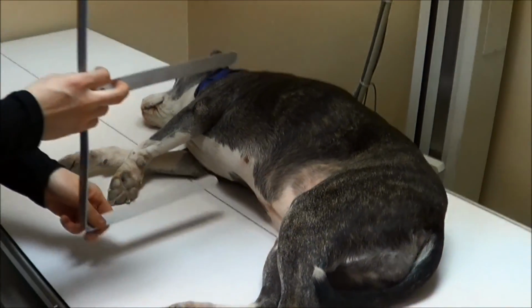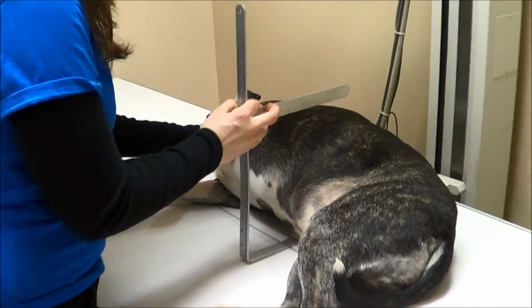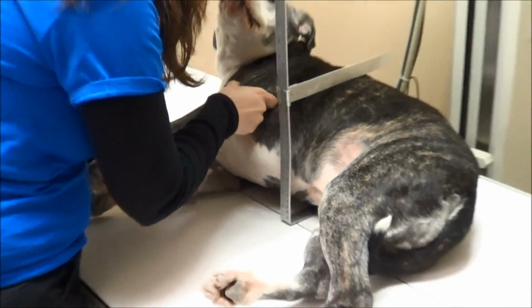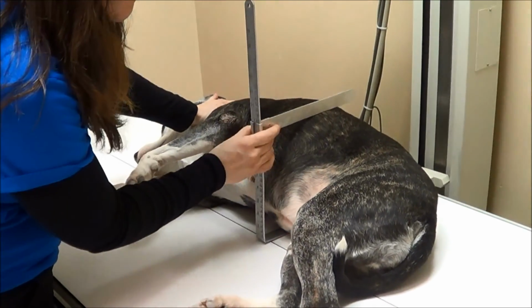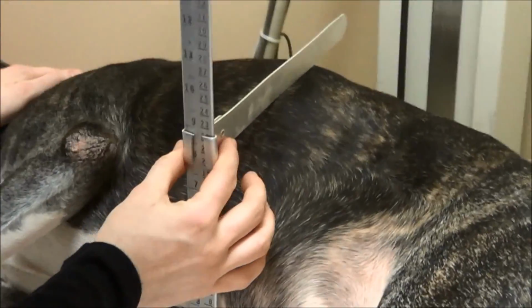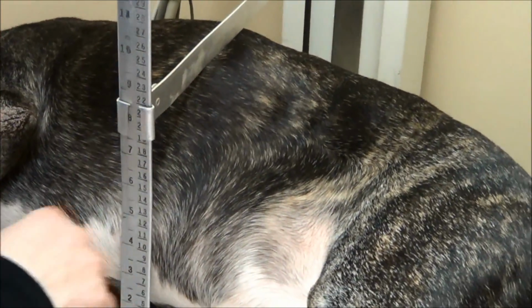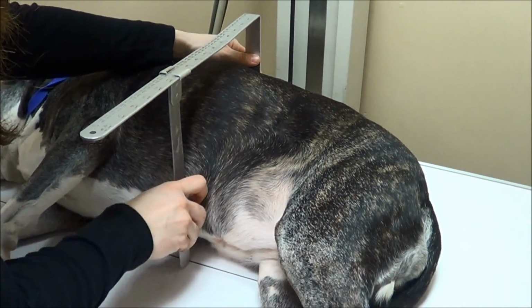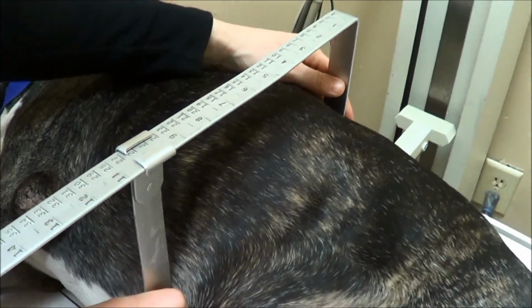And this is Ivy. She is a technician's pet, about 12 years old, I believe. Spayed female, pitty mix. So you want to measure the thickest part of the abdomen, which is about the 12th rib. And she measures to be about 19 centimeters lateral. For the VD view, same spot, you want to measure at the 12th rib, and she's about 24 centimeters.